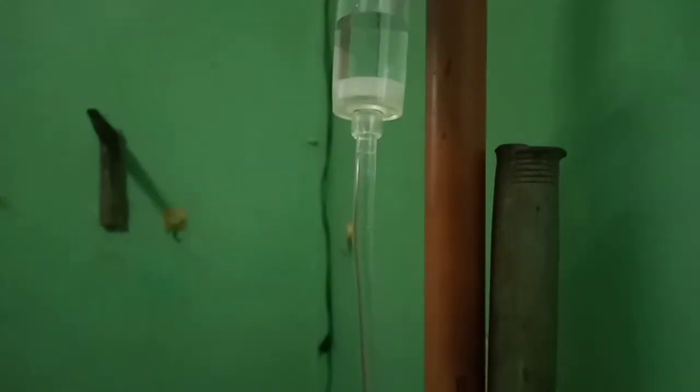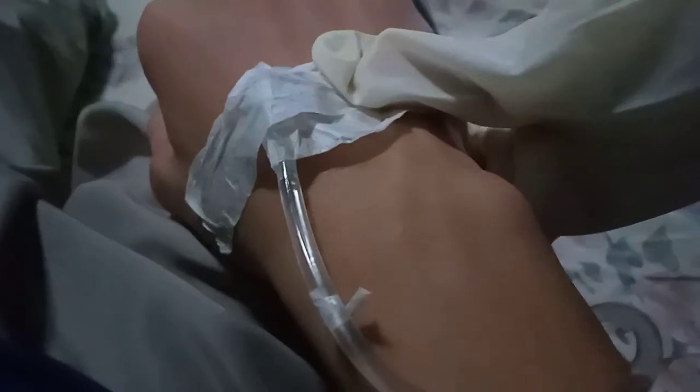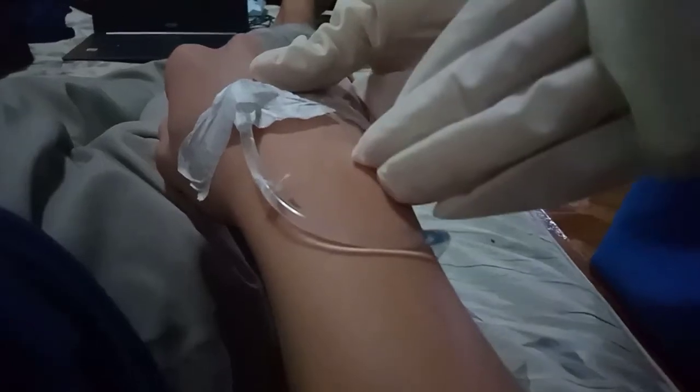Any kind of pressure on the tubing may interfere with flow. The catheter may become dislodged from the vein, and the IV solution may flow into the subcutaneous tissue. Chemical irritation or mechanical trauma causes injury to the vein and can lead to phlebitis. Phlebitis is the most common complication related to IV therapy.